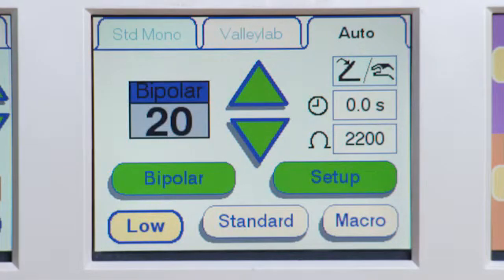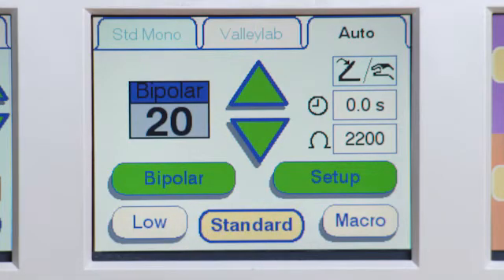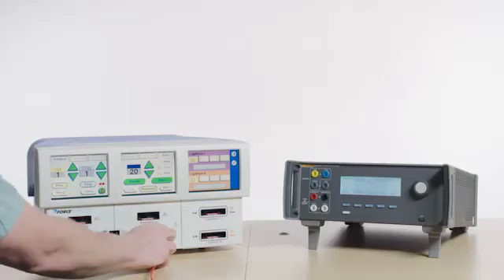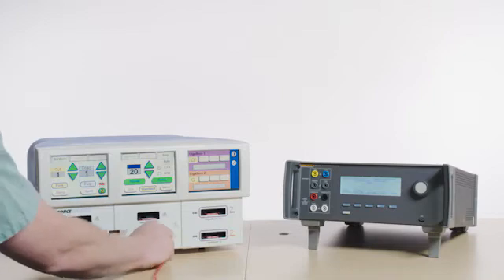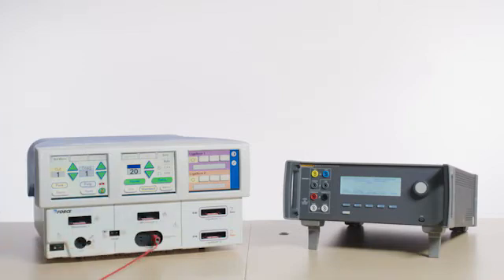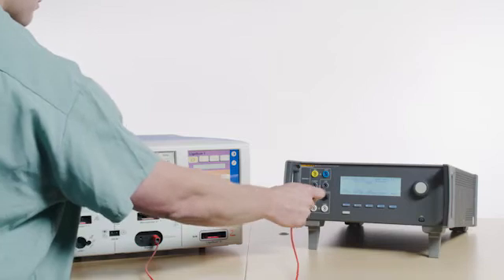Set the time to 0.0 seconds. Set the resistance to 2200 ohms. Press the back button on the Force Triad once to go to the auto bipolar screen. Press the standard button to select the proper mode. Connect the red test lead to either jack on the bipolar port of the Force Triad.